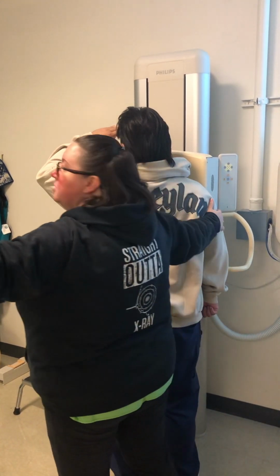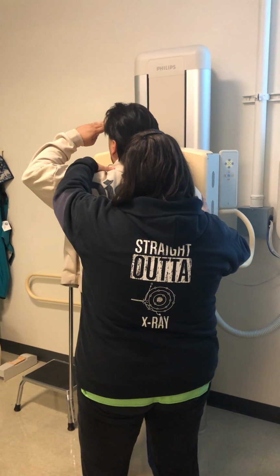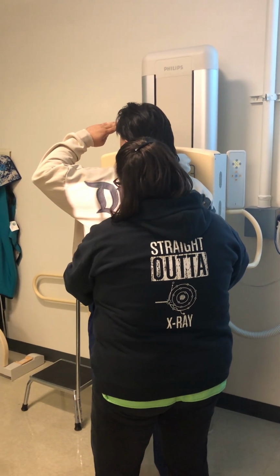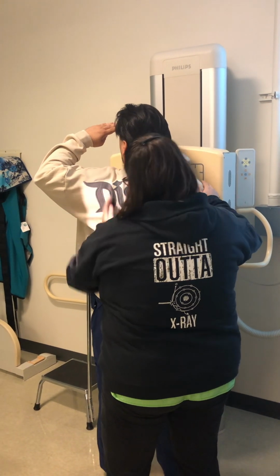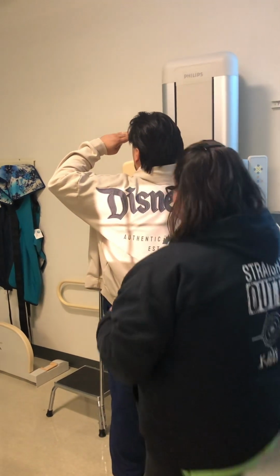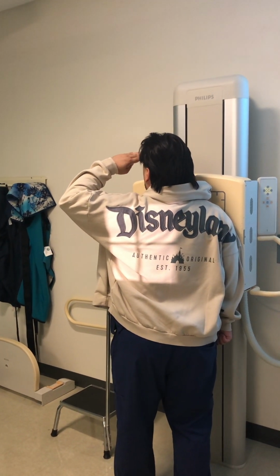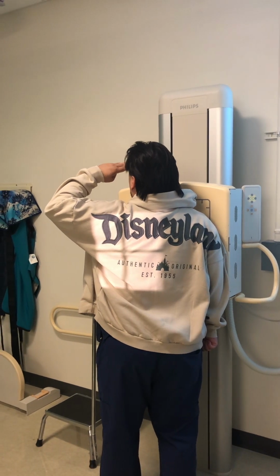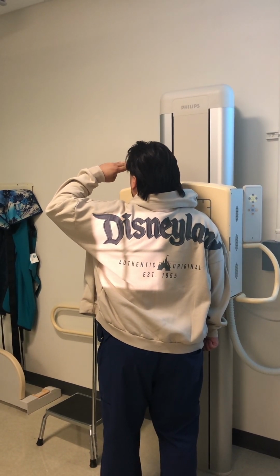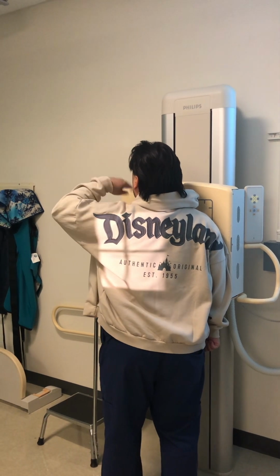Step a little to your left. Step forward a little bit more. Shift, shift. Okay. So that would be again the RAO, but for a left anterior upper rib injury. Questions about those ones? All right.